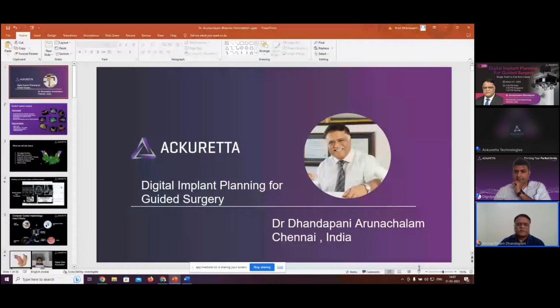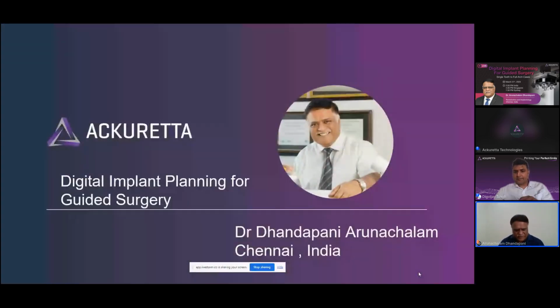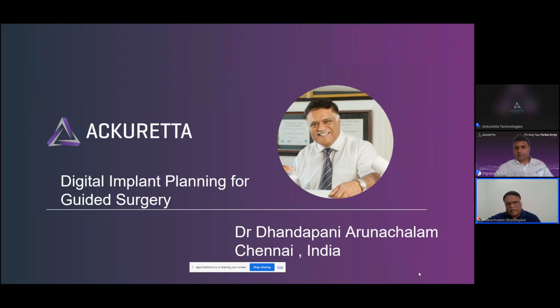Okay. So today's presentation is essentially about digital implant planning for guided surgery. The whole idea being that if you were to have a pre-operative assessment, a pre-operative fabrication of a template that enables you to place your implant three-dimensionally in the most accurate or most desirable optimal position, then a good surgical guide is probably one of the best options for you to go.